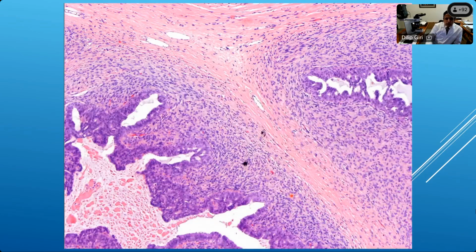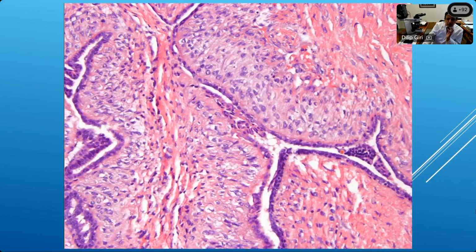And then as you moved to the periphery of this lesion, you started seeing this subepithelial condensation. But even here, the periductal stromal proliferating cells are very atypical. So if this is what was seen in the biopsy, a diagnosis of fibroadenoma would never have been made. But as you went further to the periphery of this lesion, you started seeing a blander type of appearance, right? So there is subepithelial condensation, but it does not look as atypical as it looks here.